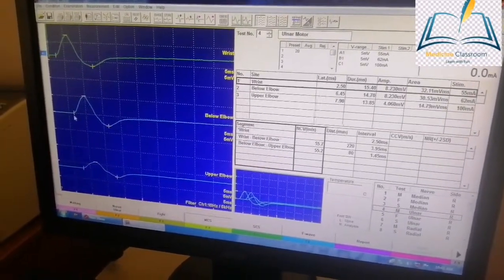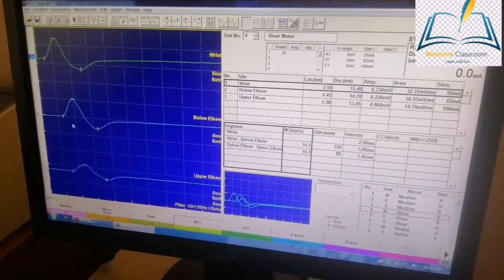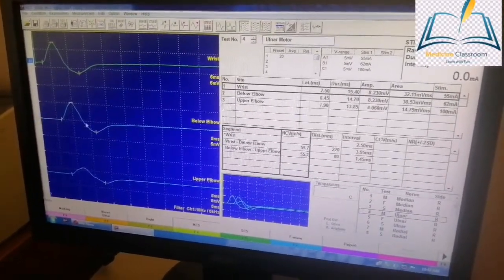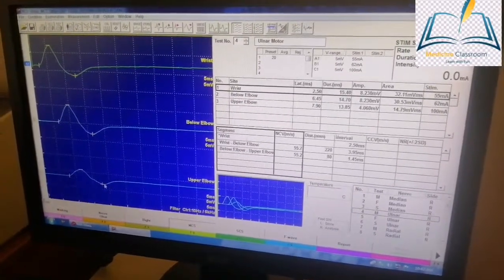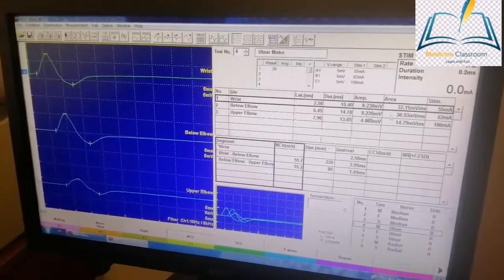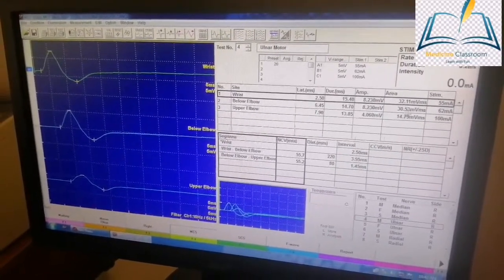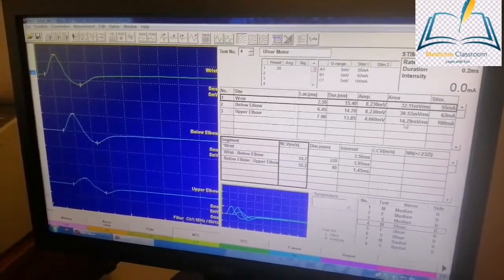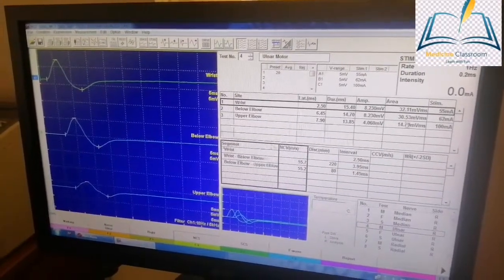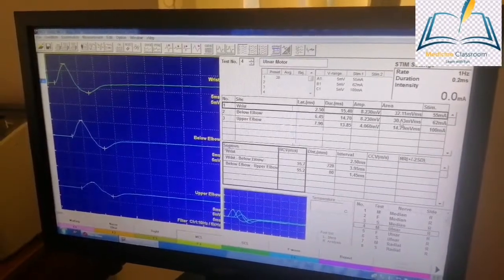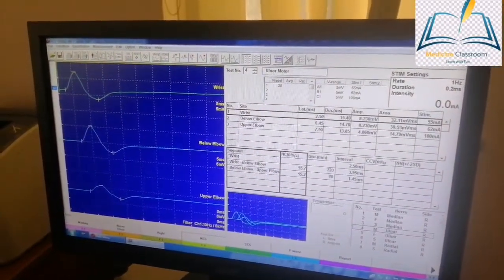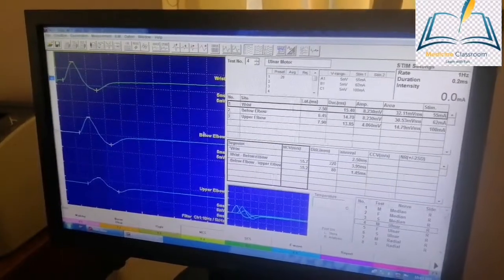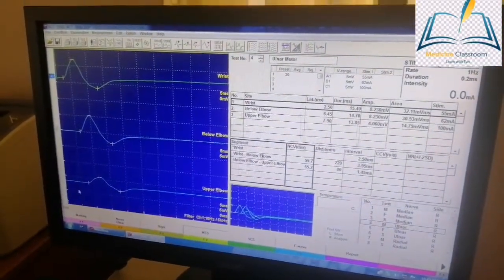Second thing we have to look for is temporal dispersion. For temporal dispersion, you have to calculate this area, also called the compound motor action potential area. In the below elbow stimulation, the area is 30.53. In the upper elbow it is 14.79. If you take out the ratio, if there is prolongation of the area by at least 1.15, that's significant. You can see there is temporal dispersion here as well.